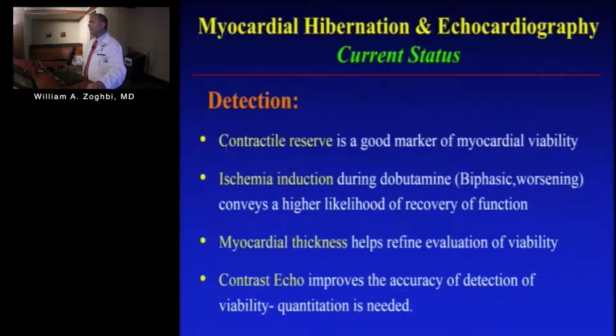So bottom line, from an echo point of view, and I'm going to stop here so I'll give enough time for the other presenters and for discussion, nowadays for echocardiography, you look at the ventricle, how remodeled it is, and there are some data I didn't add in the slides here, telling us about the remodeling and the effect.